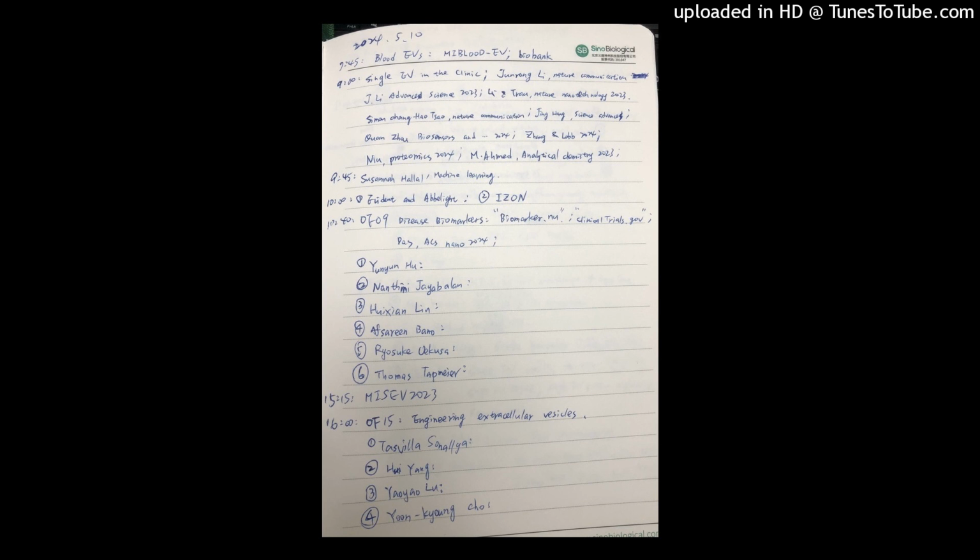This is a study that I'm completely not involved in, but I think Fabrice is the leader together with Fazer Daniel, and they have an international biobank study ongoing where they try to identify the most used protocols, and they are doing a head-to-head comparison of the plasma and serum quality. Of course, again, the only goal of all this, a very simple idea, is that we would like to improve the quality of the samples that we use as a starting material for blood EV research.